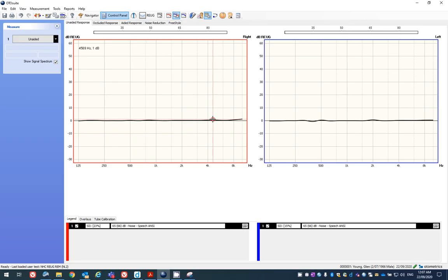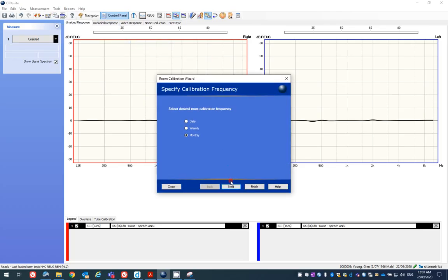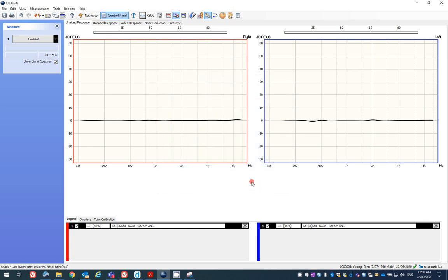If this wasn't correct, the next step would be to do a room calibration. So we go to our Tools, Freefit Calibration, Room. Next, Freefit is turned on and within reach. Okay, and there's our room calibration complete.